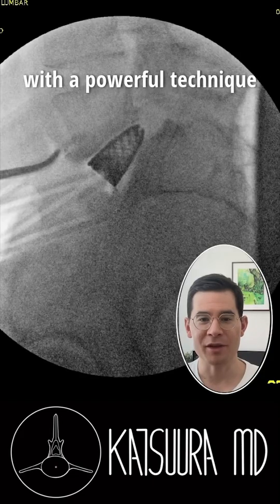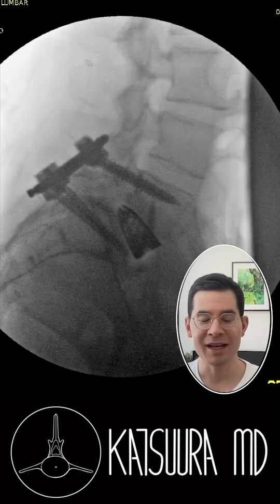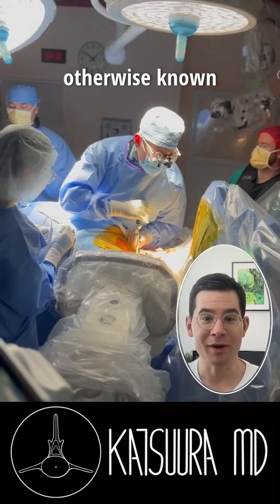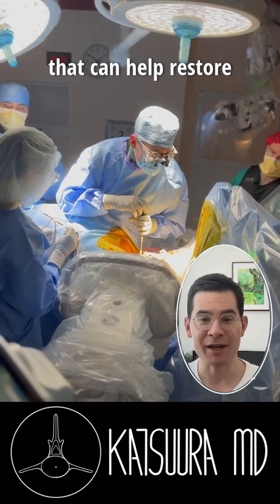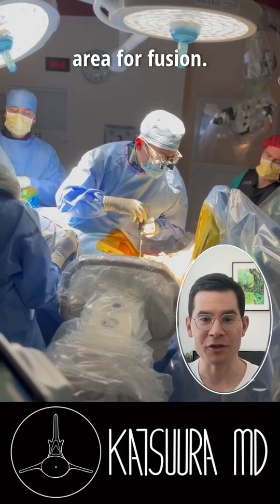I elected to treat this patient with a powerful technique known as the anterior lumbar interbody fusion and posterior percutaneous pedicle instrumentation, otherwise known as the A-LIFT procedure. This is a powerful procedure that can help restore the shape of the spine and creates a large surface area for fusion.